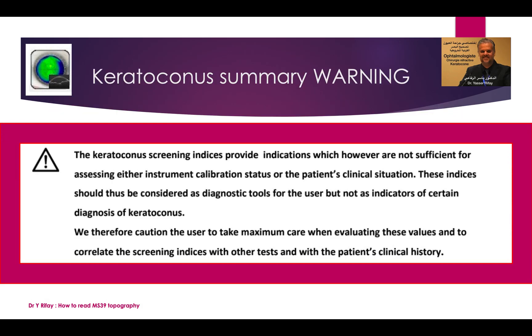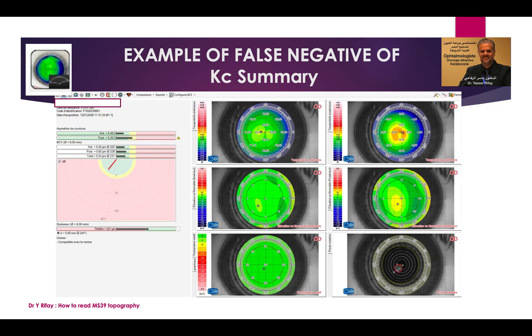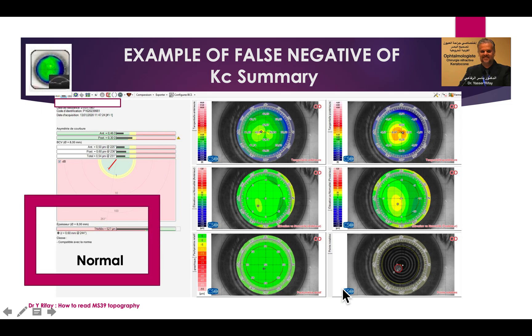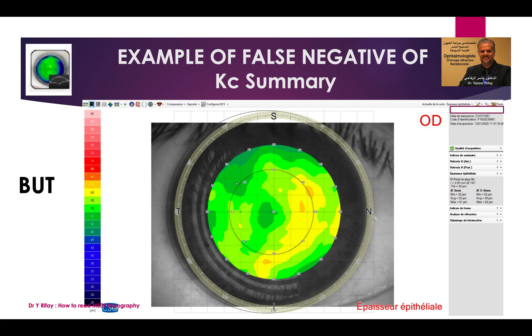The keratoconus screening indices provide indication, however they are not sufficient for assessing instrument calibration status or the patient's clinical situation. These indices should be considered as diagnostic tools only for the user, not as indicators of a certain diagnosis of keratoconus. For example, a false negative of the keratoconus summary: in this case you will find a normal result, but if you look at the epithelial mapping you will find a donut image which is highly suggestive for early keratoconus. So this is a false negative.